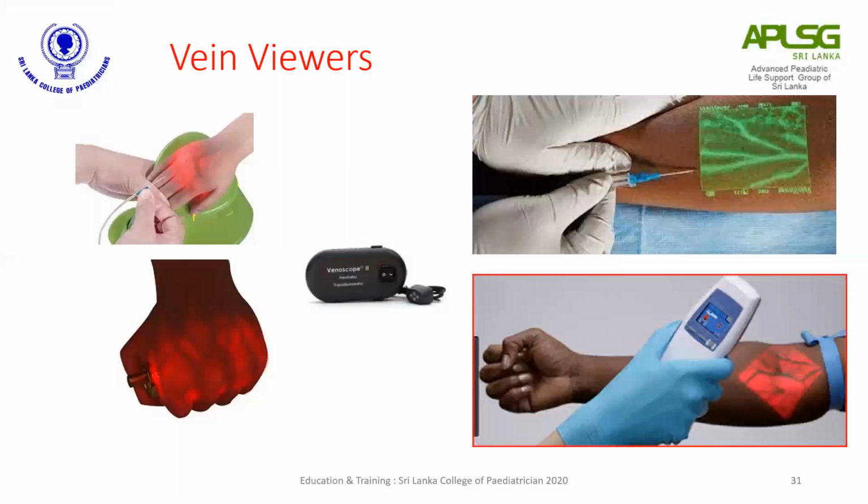In difficult cases, another piece of equipment that you can use is the vein viewer. How does it work? The vein viewer projects an infrared light, which will be absorbed by the hemoglobin in the blood, but the light will be reflected by the surrounding tissue, so that you can get a clear image of the venous pattern. But there are certain limitations. As it detects the hemoglobin in the blood, there should be good blood flow through the vessels to get a clear image of the vessel. So in a patient who is collapsed, it may not be that successful.